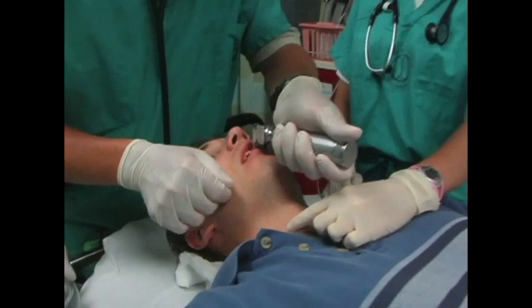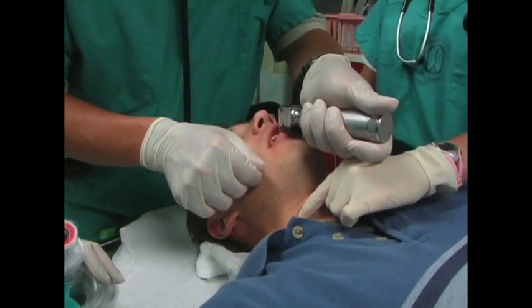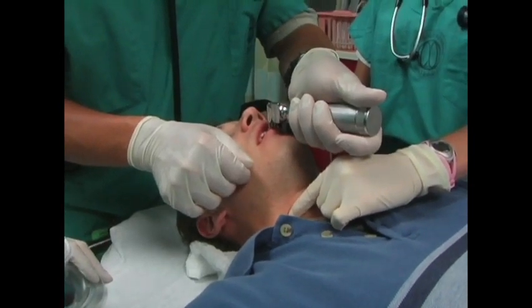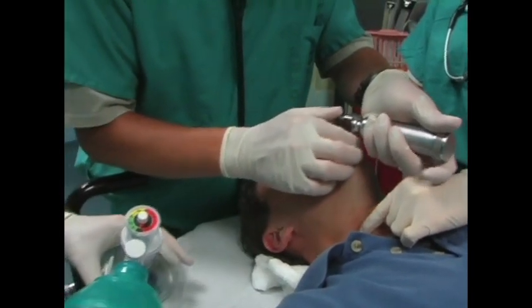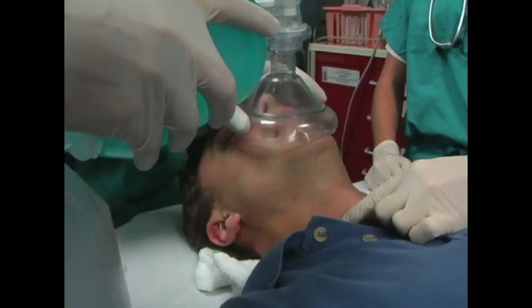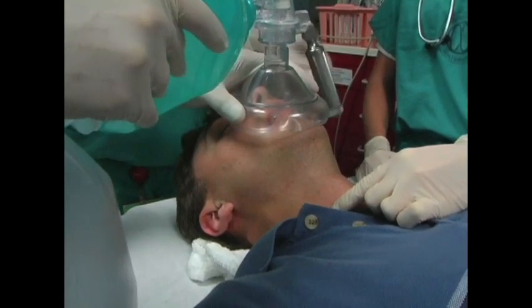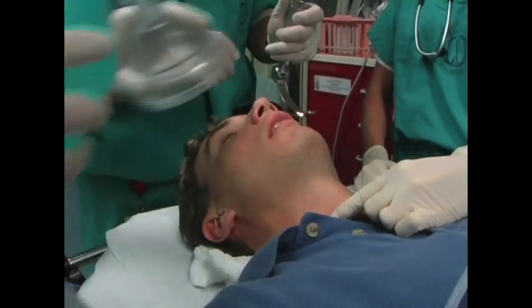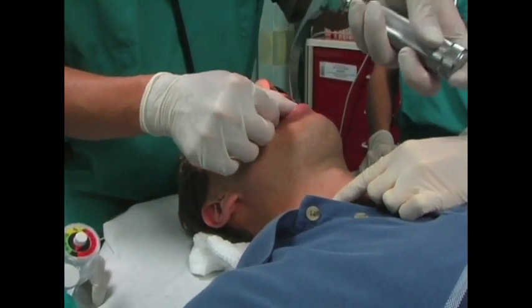If you are unable to visualize the vocal cords, the burp maneuver may be utilized. This procedure entails manipulation of the thyroid cartilage using backwards, upwards, rightwards pressure, which may bring the cords into view. If unsuccessful, reoxygenation may be required utilizing the bag valve mask device. The operator may consider changing the blade, the tube size, or repositioning the patient prior to further attempts at intubation.